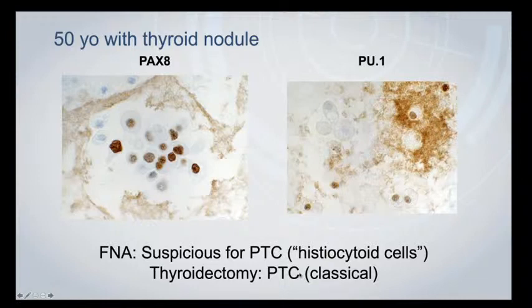And if you look at histologic sections of classical PTCs, you will find the morphologic counterpart of these cells. They don't look especially like papillary thyroid carcinoma, even histologically, but in other areas you have classic features of PTC, which makes the histologic diagnosis so much easier. It's cases like this again that would fit nicely into the suspicious for malignancy category. I think very few people would feel comfortable calling a case like this, frankly, malignant.